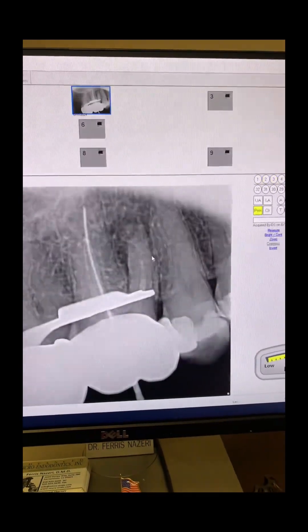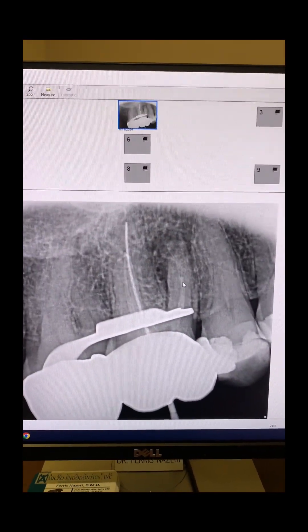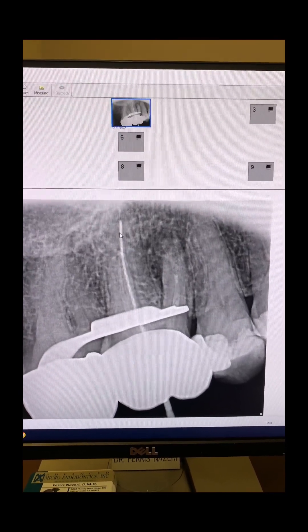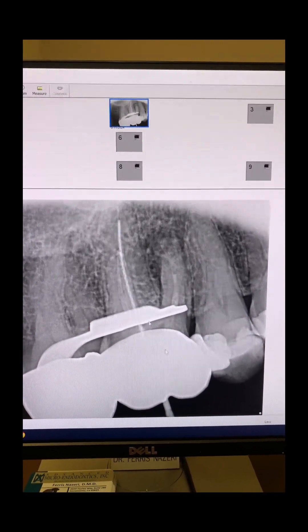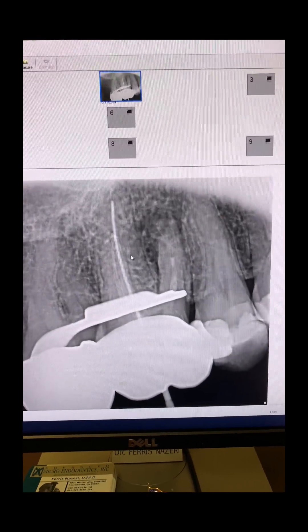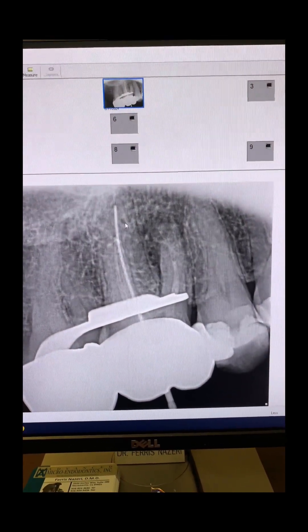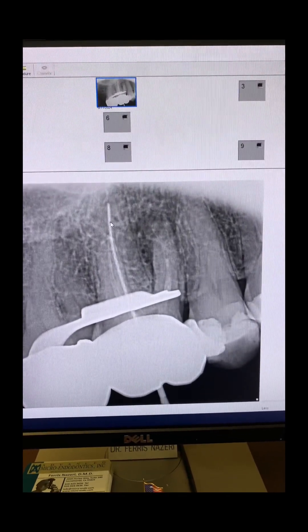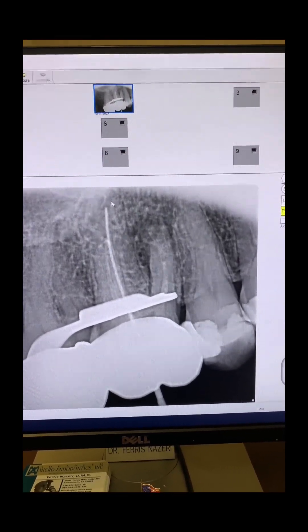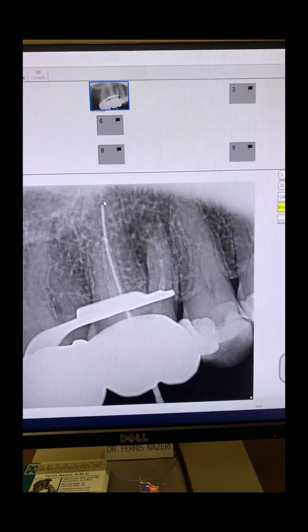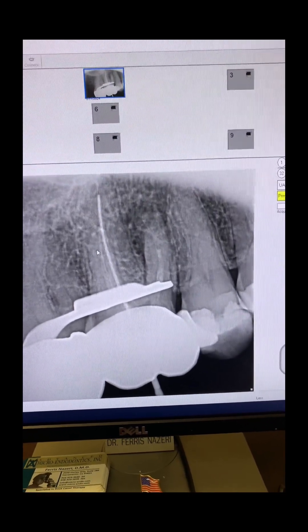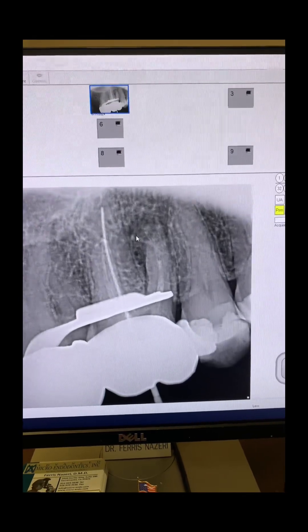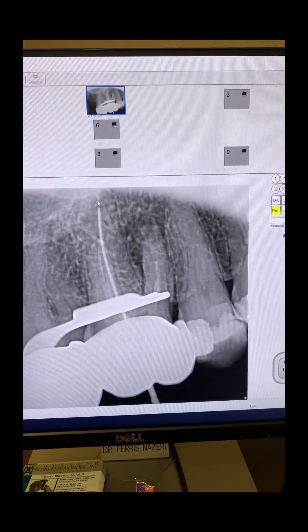Mid-treatment, after removing most of the gutta-percha, I was trying to get a working length on the palatal. The estimated working length from our radiograph was 21mm, but I was at 23mm and still not getting a signal from the apex locator. I went to my working length PA and, as you can see, I was a bit short — the working length on the palatal was actually 24mm.